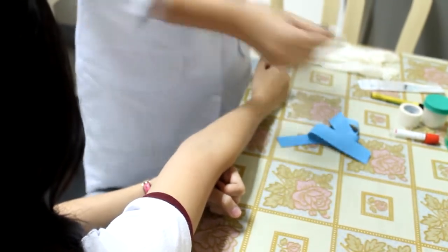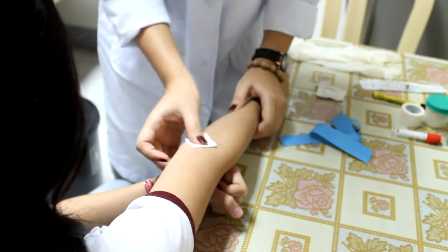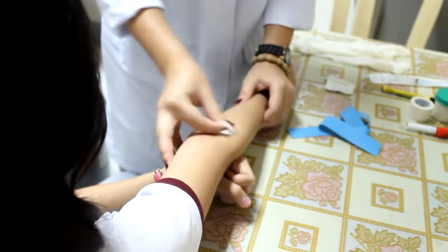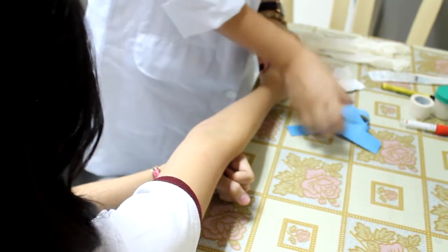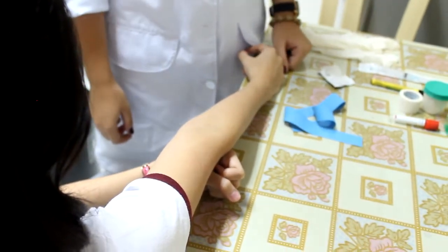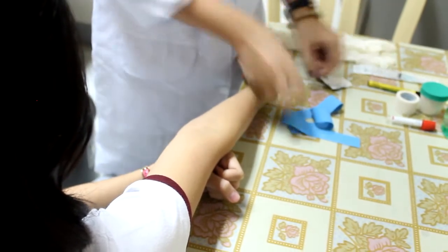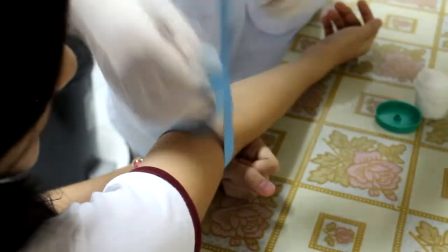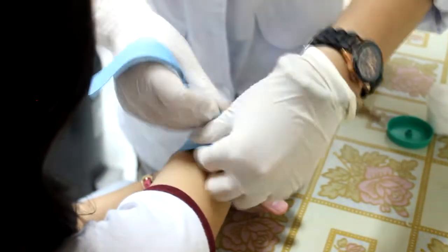Clean the puncture site in a circular outward motion using a 70% isopropyl alcohol pad. Allow the skin to air dry for 30 to 60 seconds before proceeding. Do not touch the puncture site after cleaning to avoid recontamination. Perform the venipuncture. Reapply the tourniquet and remove the cap of the syringe.